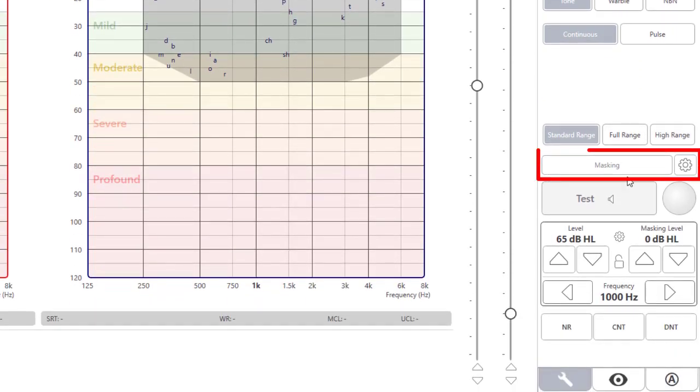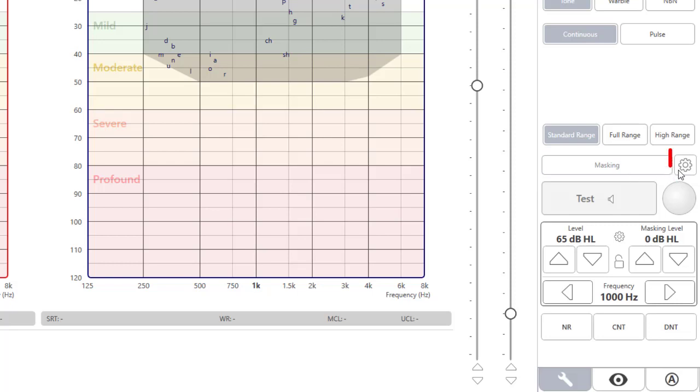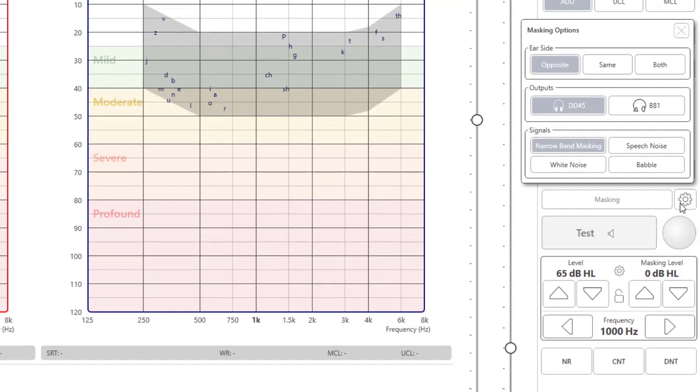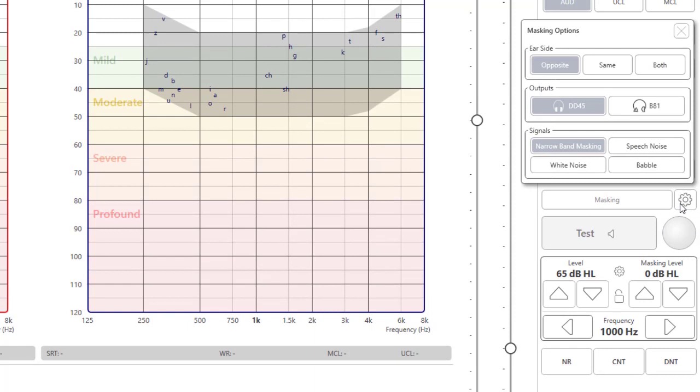The masking bar is displayed next. Click on the masking bar to turn masking on. Click on the drop down to see the masking options. For standard testing, masking will be set to opposite ear and the proper transducer and proper stimulus will be selected.